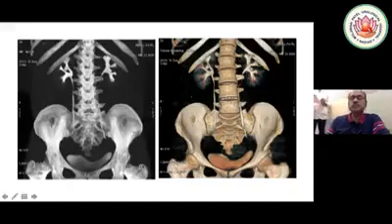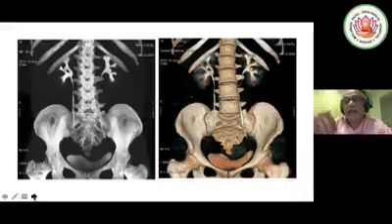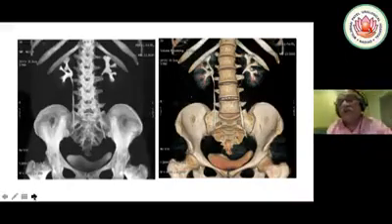Yes. Can you hear me? Yes. What I had planned in this case, we have put a DJ stent, and we're going to do a ureteroscopy. We can clear the infundibulum and the upper calyx, but this side, the lateral calyx is at an angle. You cannot do it with the ureteroscope. And in the supine position, we are planning to do a microperc, where you would be able to puncture that small calyx. You can see that on ultrasound very well, and you would be able to puncture.